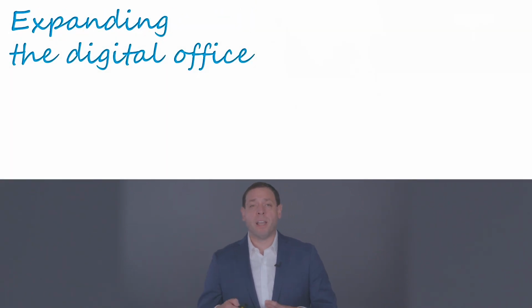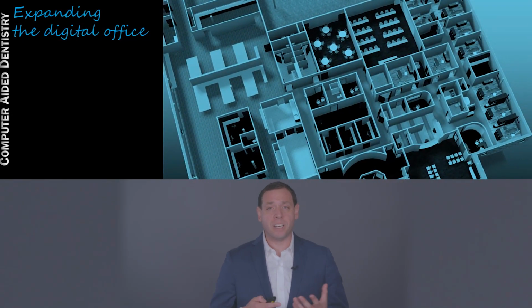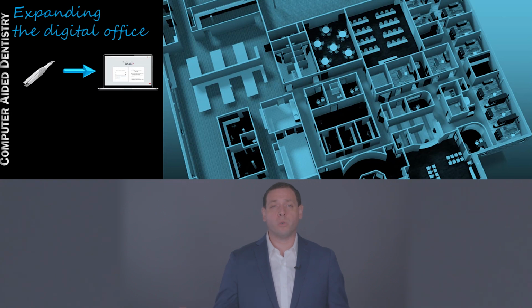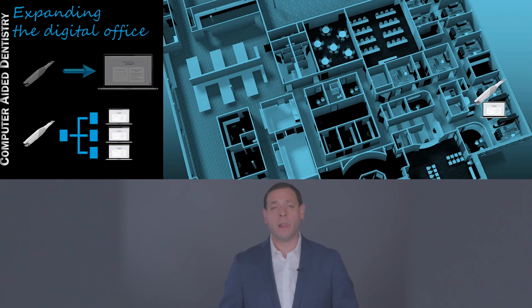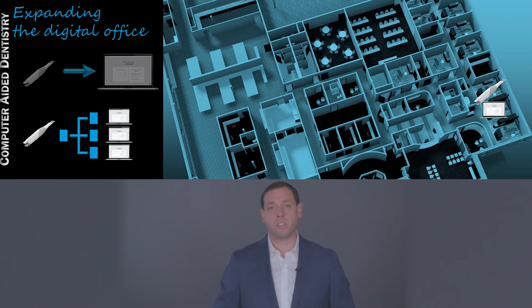Another concept is expanding the digital office. In our office, we have an intraoral scanner. And most offices who have an intraoral scanner have it plugged into one computer, and that's where your scans are kept. What we've seen happening as a trend now is that we want to be able to use those scans in multiple places around that office. And that's what we call expanding the digital office.